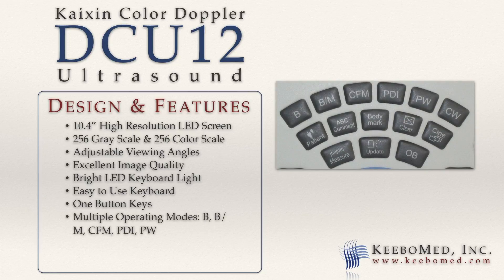Multiple operating modes are included: B-Mode, B-M Mode, Color Flow Mapping Doppler Mode, Color Power Doppler Mode, and Pulse Wave Mode.